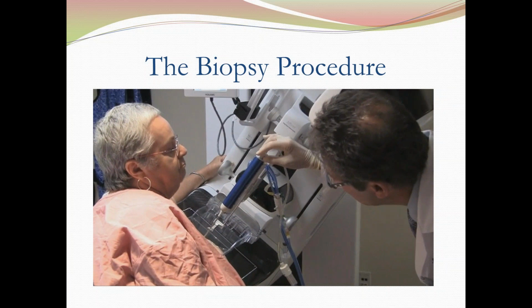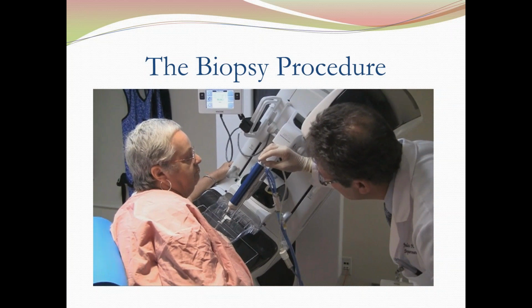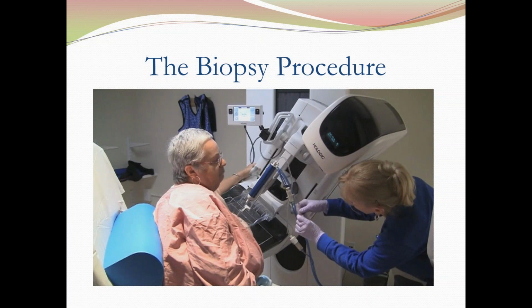And now I'm doing my biopsy, vacuum-assisted biopsy. I typically do 6 every 2 points along the clock, 2, 4, 6, 8, 10. Do 6 biopsies. And you can see this isn't hurting her at all.